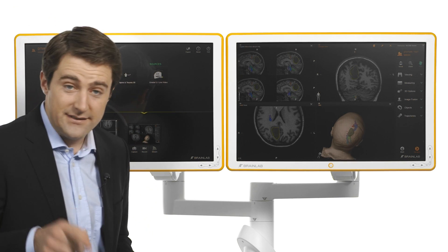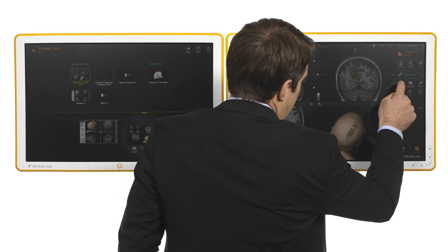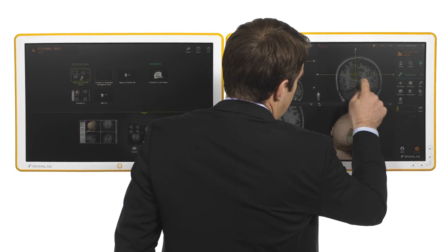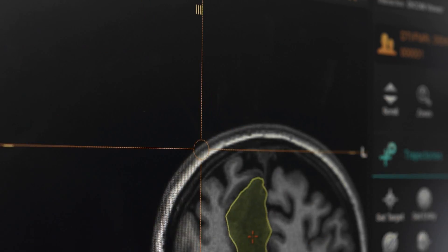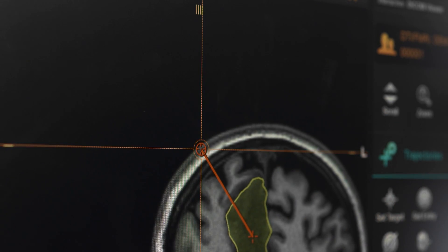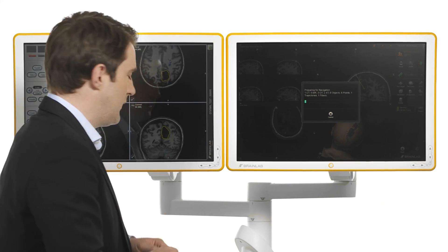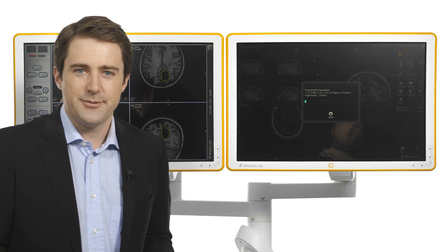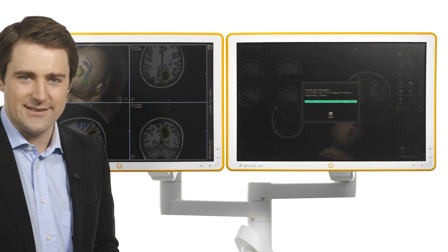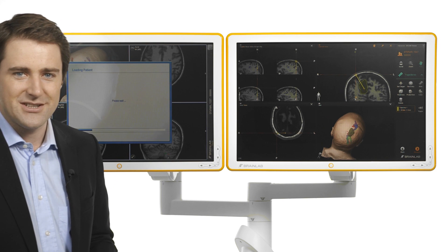In this case I add a trajectory by setting the target, moving the crosshairs, and establishing an entry point. A pop-up message informs me that the new data has been successfully synchronized with the navigation application.